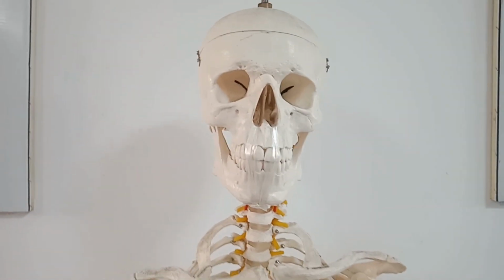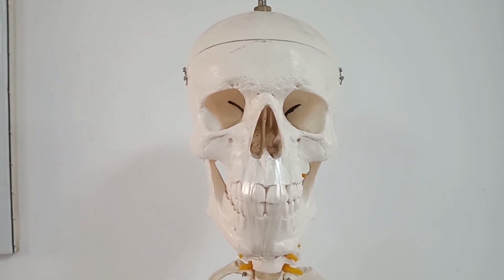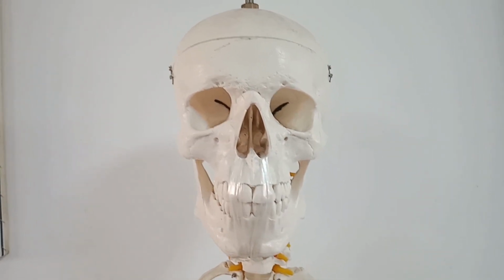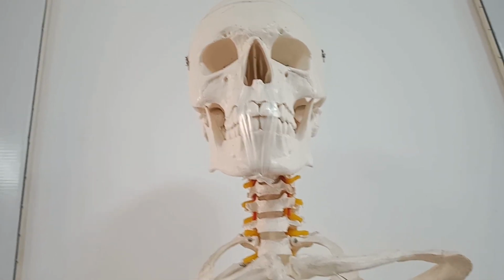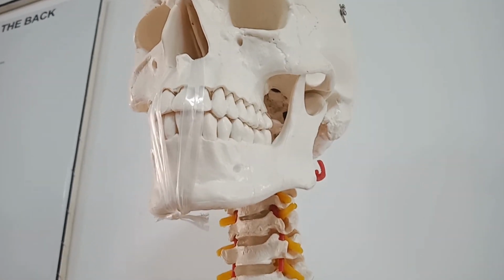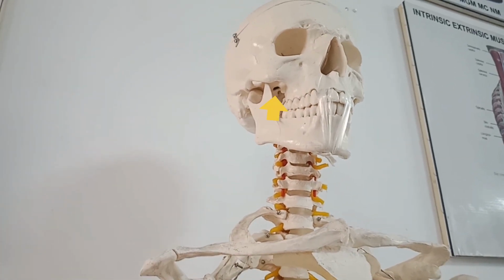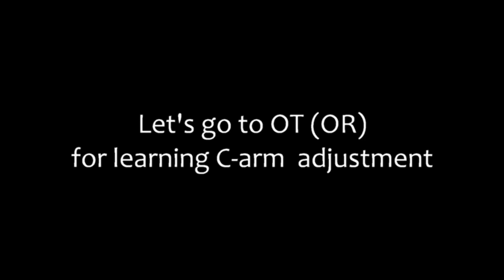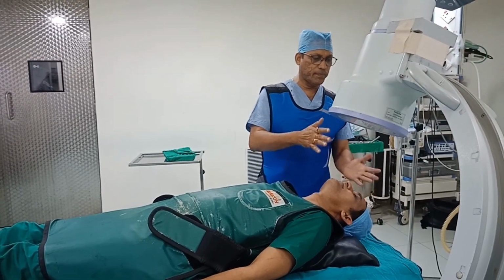Showing again, see AP view. I am watching, that means who am I? I am the image intensifier. That's my eye. I cannot see it in AP view. I have to come to submental, okay? Then oblique. We can see the foramen ovale. So it looks like oblique, but actually it is AP with the patient.